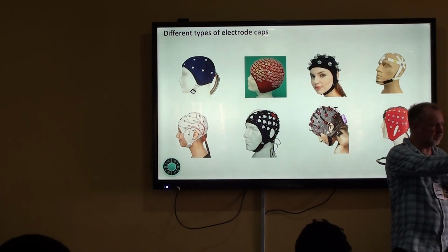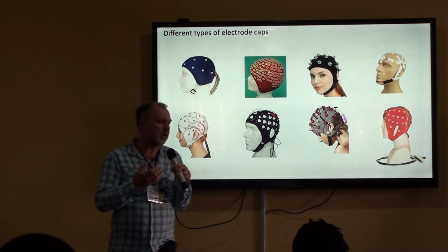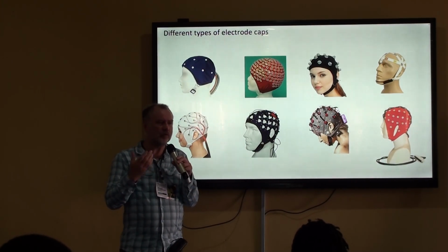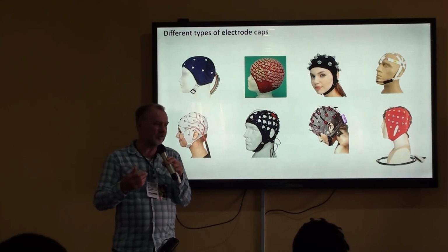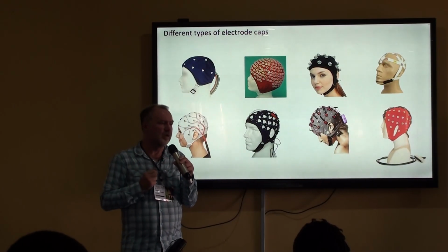So I think that research applications in mindfulness can of course be done in a laboratory environment. And if you have a laboratory environment, then you would have a researcher and a participant. And sometimes you have a research assistant, so there's one or multiple people that can help by putting on the cap.